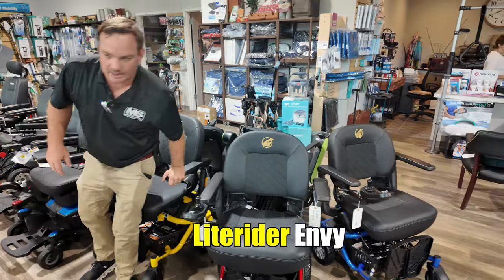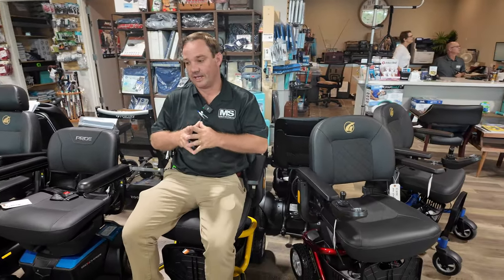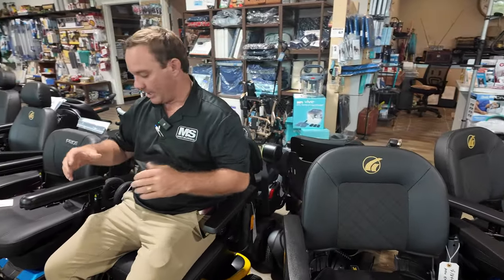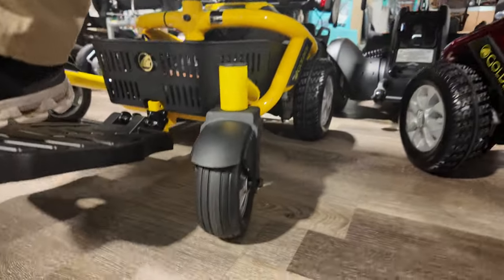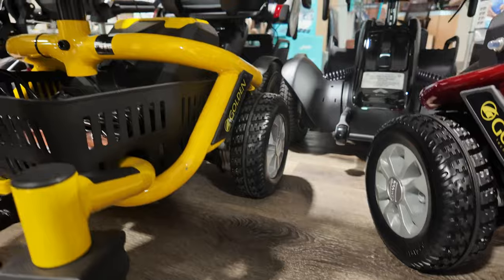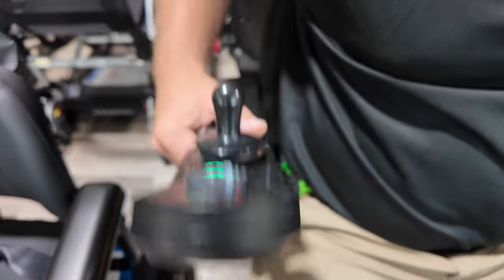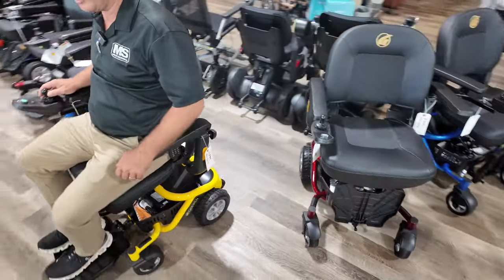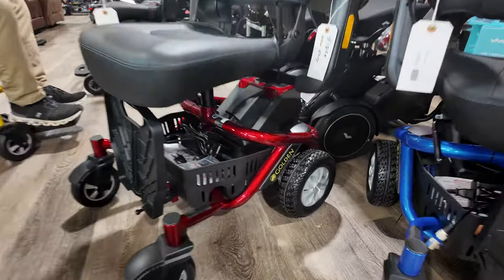Here is the LiteRider Envy. If someone wants a chair for inside and outside that they can take to stores and travel with, I would show them this over the Go Chair because the ground clearance is higher on the Envy. This model is in yellow. It has a 12V 22 amp-hour battery so the battery range is a little longer than the Go Chair. It has the link-style joystick, flip-back arms, you can get a 20-inch wide seat, disassembles very quickly, and it's about 23.5 inches wide.